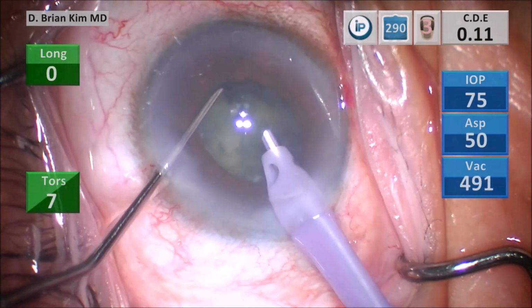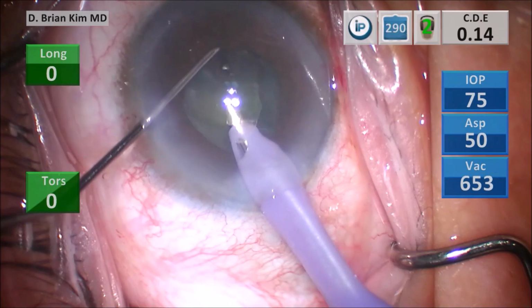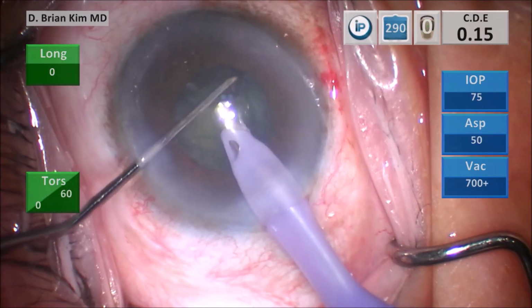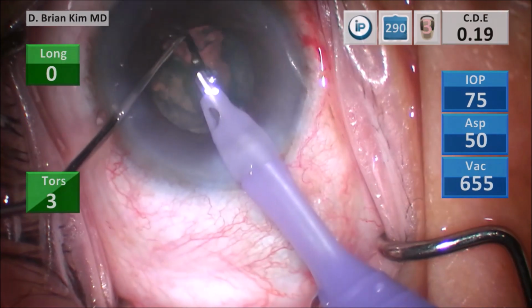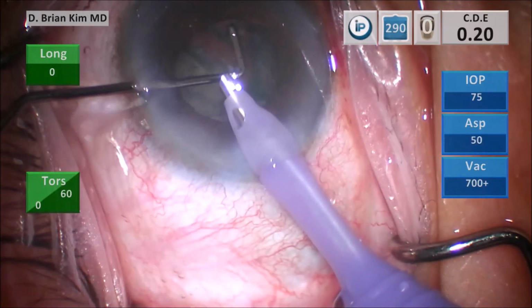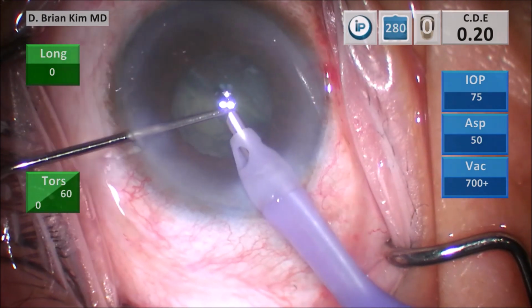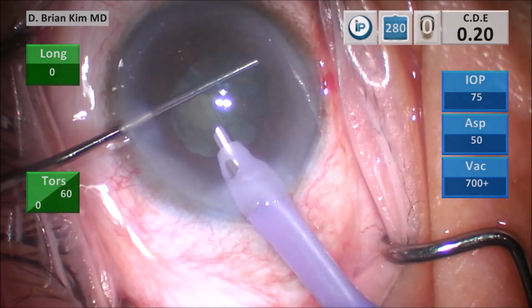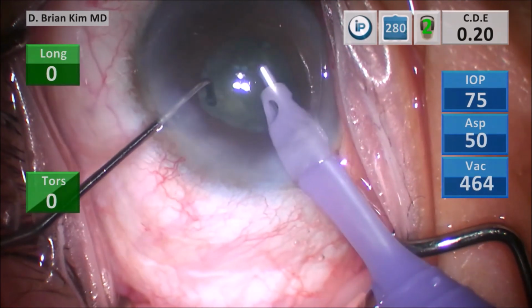Once the lens pieces are liberated, I begin crushing and removing the lens pieces using intermittent bursts of ultrasonic energy, as well as using high vacuum. I'm very careful to make sure I'm crushing and sandwiching the lens pieces. Again, I'm going under the epinuclear shell. So again, I remove the surface epinuclear material at the beginning of the case. I make sure I'm under that epinuclear level.